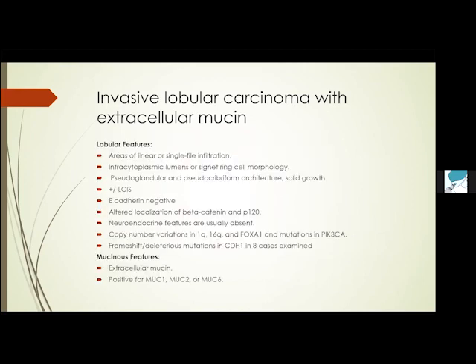The lobular features are areas of linear or single file infiltration, intracytoplasmic lumen or signet ring cell morphology, pseudoglandular and pseudocribriform architecture, and even solid growth may be seen in these cases. It may or may not have accompanying LCIS. If you have it, it is certainly a clue.